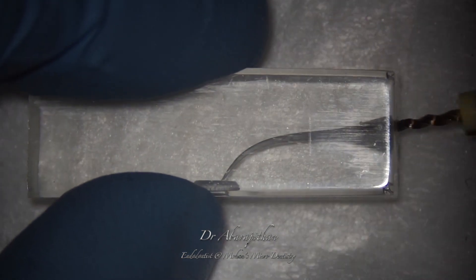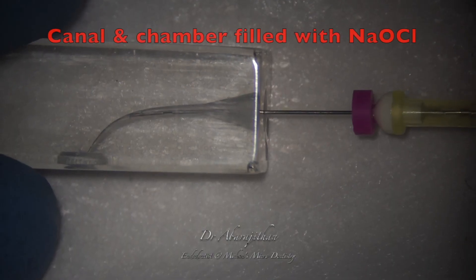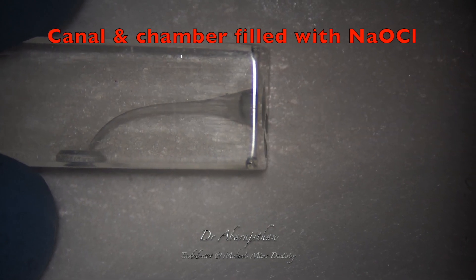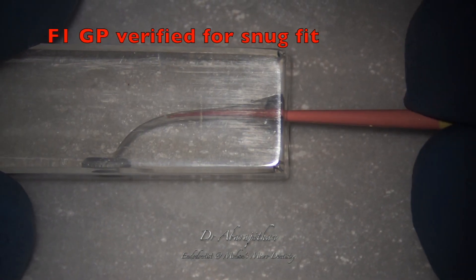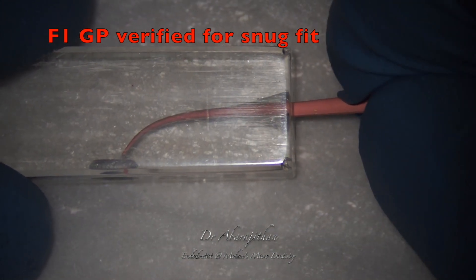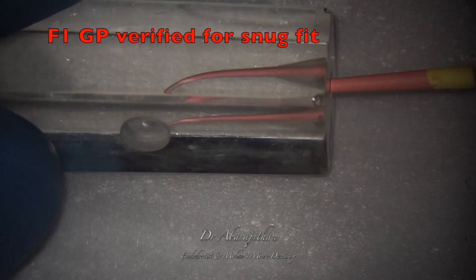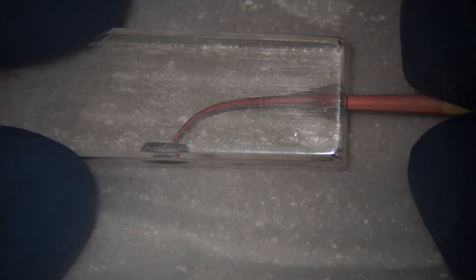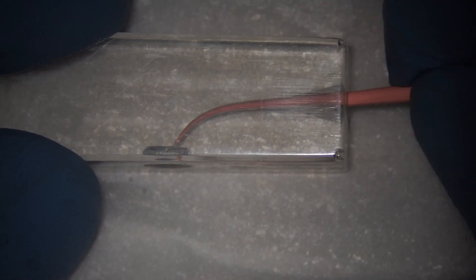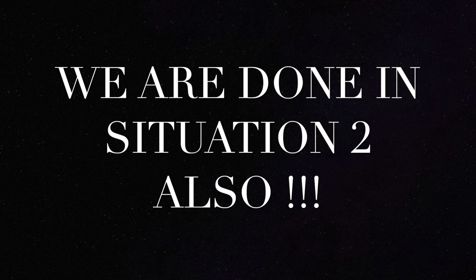Following this, we again remove all the debris with saline irrigation, then fill the entire pulp chamber and canal with sodium hypochlorite. Now we use an F1 gutta percha as a master cone to verify the snug fit. Just like the previous situation, if the GP is protruding, we trim it to make it fit at the apex. If the GP is short of the apex, we negotiate the canal again — use S1 to working length, irrigate, use F1 to working length, irrigate, and then redo the master cone radiograph. When snug fit is achieved, we are done with the instrumentation and the canal is ready for final irrigation.